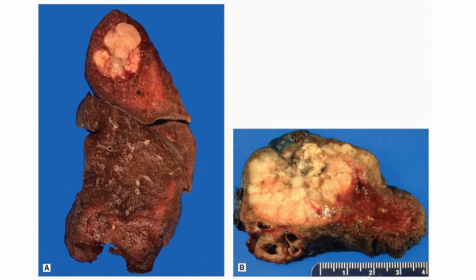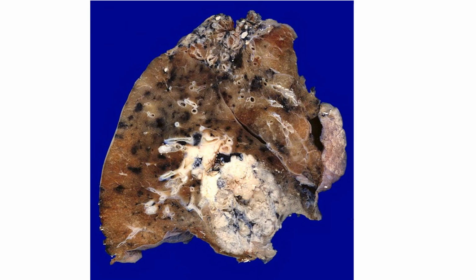The next one is lung adenocarcinoma, gross. So in cancers of the lung, typically, if you have a lesion or tumor at the periphery of the lung, it's basically adenocarcinoma. And this is cancer because you can see all the features of malignancy here. It has poor demarcation, not well encapsulated. The cut section is heterogeneous with areas of hemorrhage, the blackish, and necrosis, the yellowish.